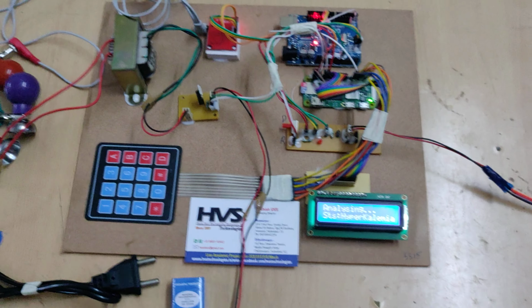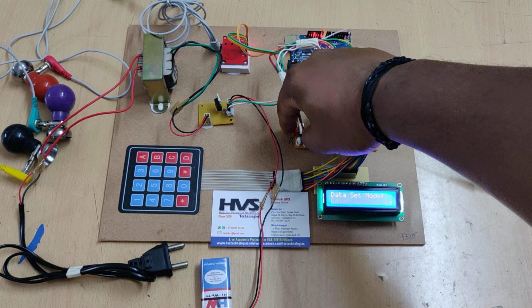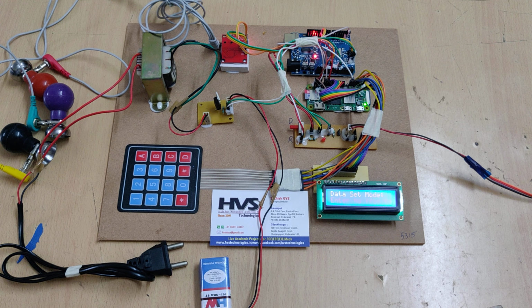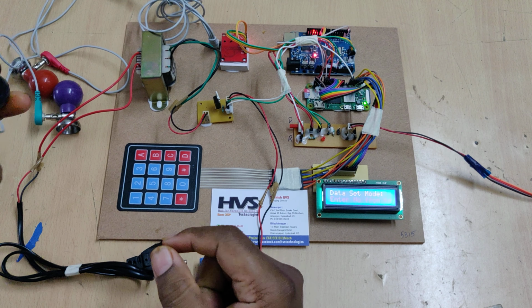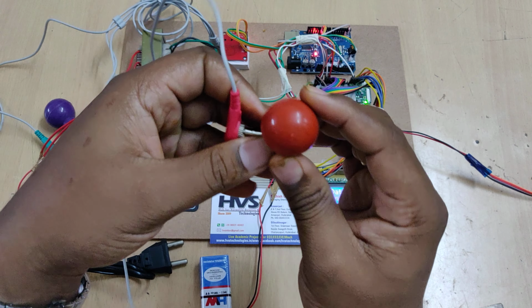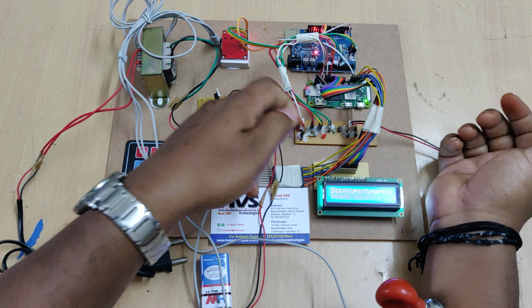Okay, and let us go with the real time mode. In that, you can change into the real time mode. The heart rate is 0. After mounting these electrodes, mount the electrodes properly on your hand, and only then you can change the mode. Otherwise it will provide us abnormal, wrong data, which also leads to the diseases. Now we are in the real time mode.